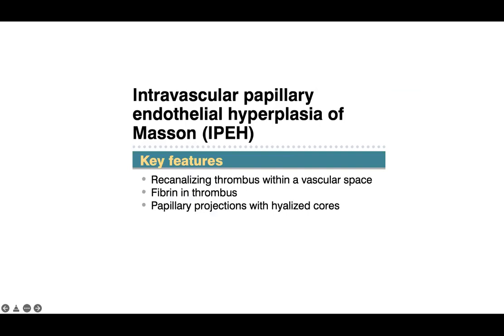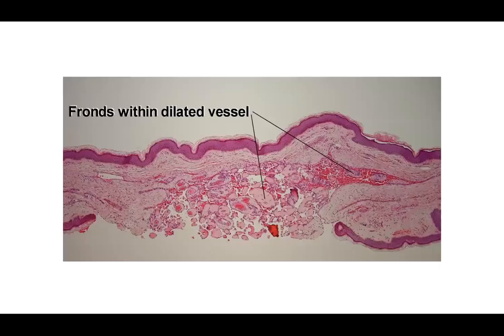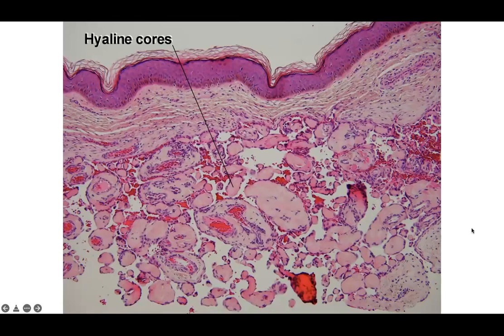Masson's tumor, also known as IPEH (intravascular papillary endothelial hyperplasia), has key features of a recanalizing thrombus within a vascular space, fibrin within the thrombus, and papillary projections with hyalinized cores. Here's an example showing the intraluminal papillary architecture — fronds within a dilated vessel with hyalinized cores. Take a mental snapshot of this. Look for those hyalinized cores and fronds in and out of the plane of section, along with bland endothelial cells inside a larger vessel, with an overlying normal dermis and epidermis.